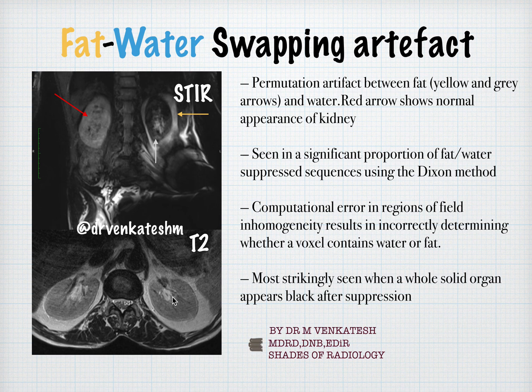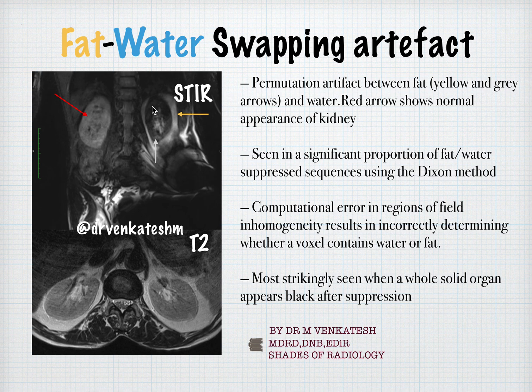So what is the field inhomogeneity in our case? There was a metallic implant — an MR-compatible metallic implant. You can see a lot of distortion, and this created field inhomogeneity. This is a fat-suppressed sequence, and this is the artifact which we got. In place of fat, the fat doesn't suppress here, and in place of water, the water becomes suppressed. Most strikingly, the whole solid organ appears black after suppression.